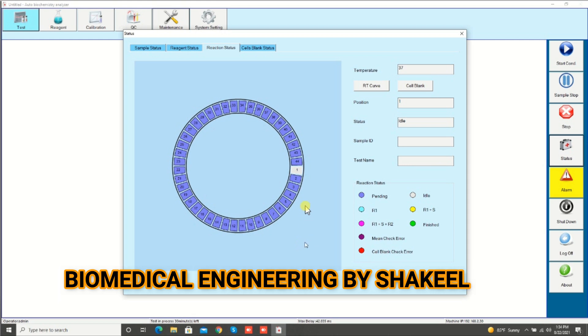You can see that position number one is now idle and number two is pending — this is also idle. The machine will now clean the next cuvette.